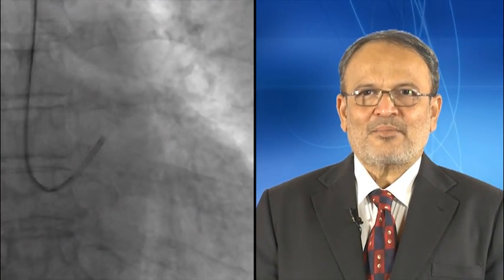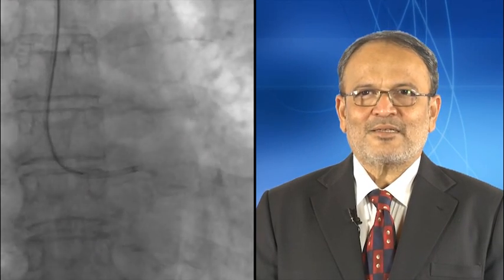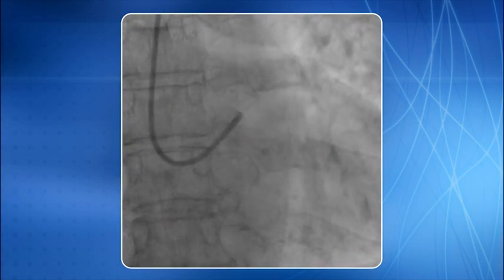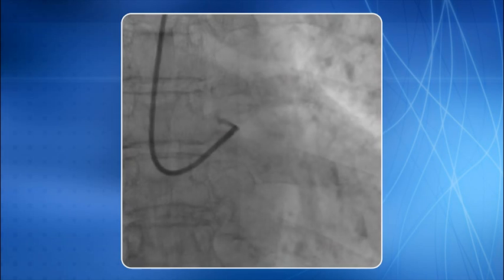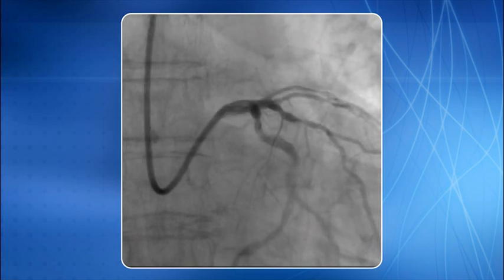I will show you LCA cannulation using an extra backup guide catheter. The extra backup guide catheter is brought into the ascending aorta just above the aortic valve. The tip of the catheter is directed towards the LCA ostium. A gentle counter-clockwise rotation cannulates the LCA ostium. It is very important to use gentle finger movement rather than wrist movement while working through the transradial approach. LCA injection is done.